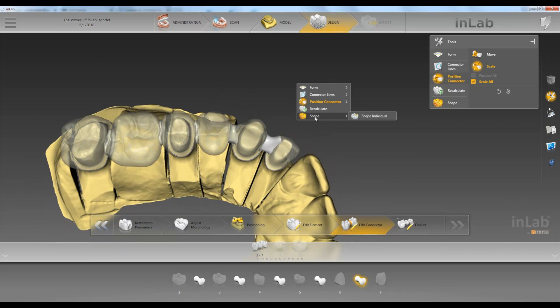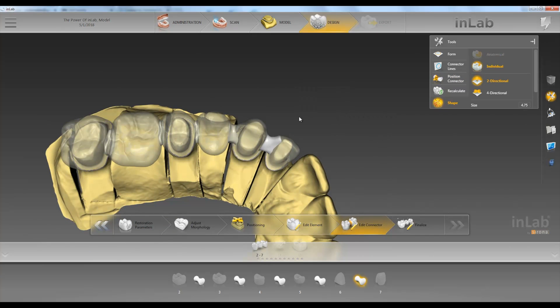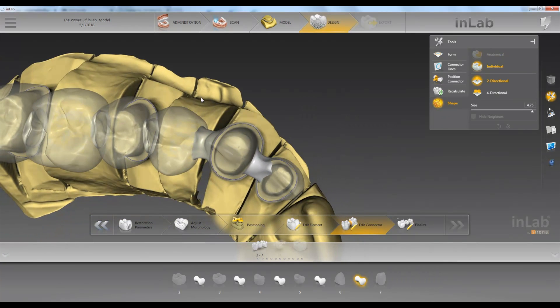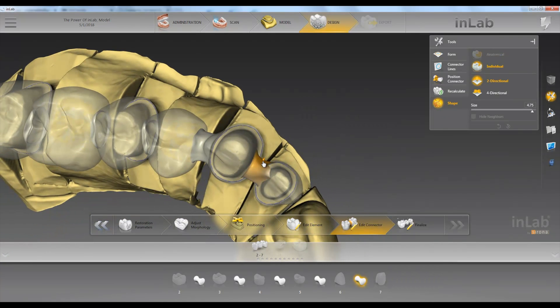Next we have the shape tool — shape individual. Let's say we wanted to pull this one out a little bit towards the buccal or in towards the lingual.